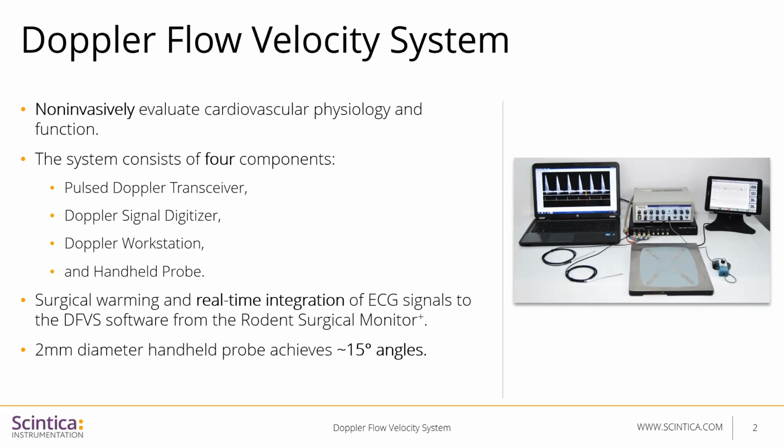When using Doppler, frequency of sound has to do with depth of penetration and temporal resolution. So as much as we want to have high temporal resolution because the animal's hearts are beating very quickly, we would use the 20 megahertz probe for the mice, and the 10 megahertz probe, which would penetrate deeper, we would use on the rats. The system also comes with a heated surgical platform.